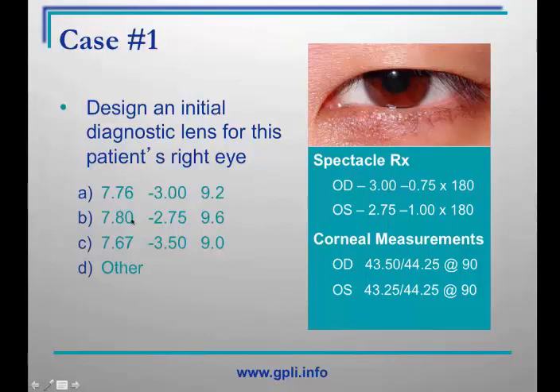Quite often the nomograms recommend that you select slightly flatter than K because the cornea is aspheric and flattens as it goes from center to periphery, so a slightly flatter than K base curve should result in a nice alignment fluorescein pattern.